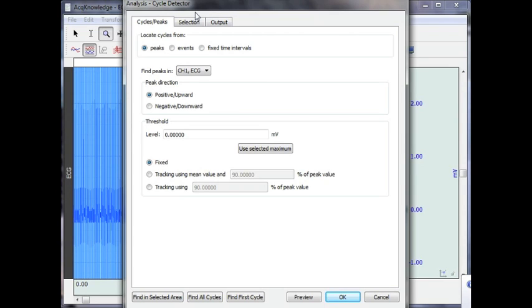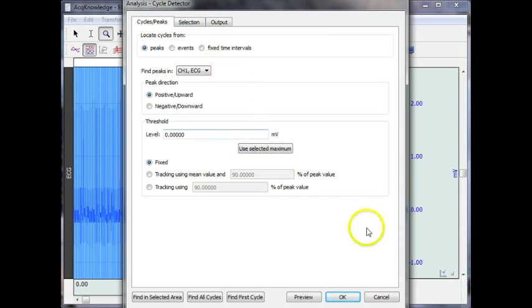This particular introduction will go through some of the basics of the Cycle Detector and show how the system can be used for taking measurements for further analysis.